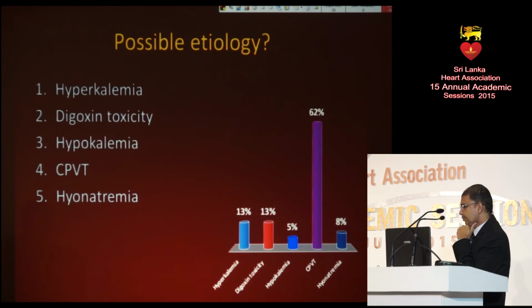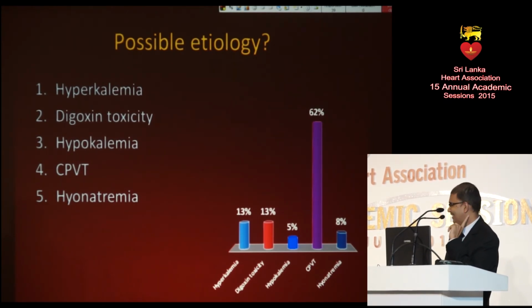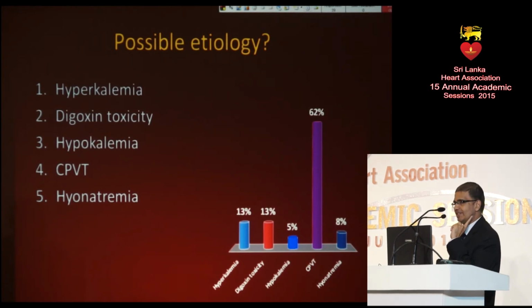All right, so we have votes there. Well, yes, most of you have voted CPVT, and I can understand why, because if you look at the question answer, that's mostly the most likely diagnosis, that's the most unusual one there. Yes, right, okay. But well spotted, yes, that's true.